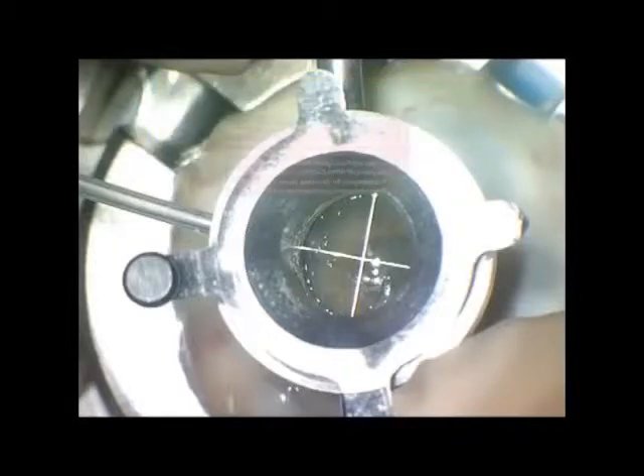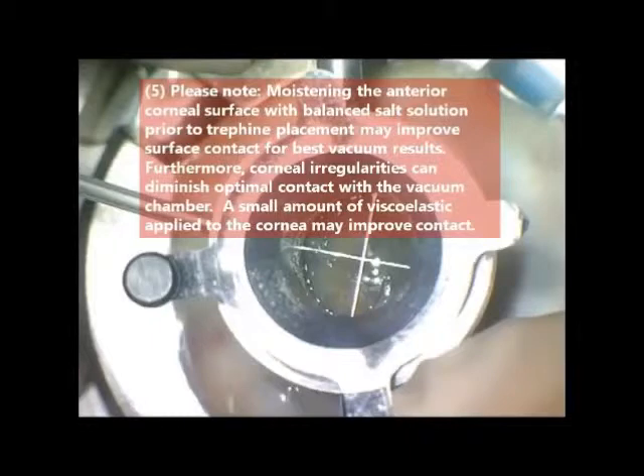Tips to improve suction: moisten the cornea with balanced salt solution prior to trephine placement. For greater irregularities, substitute viscoelastic, which may improve contact.